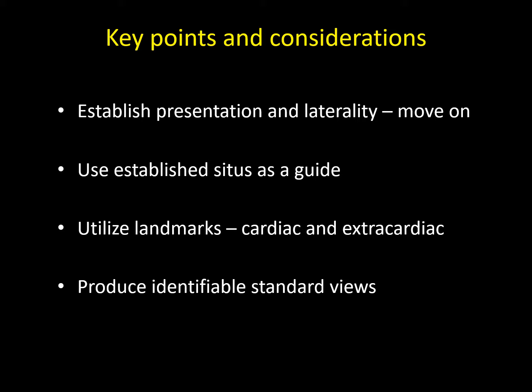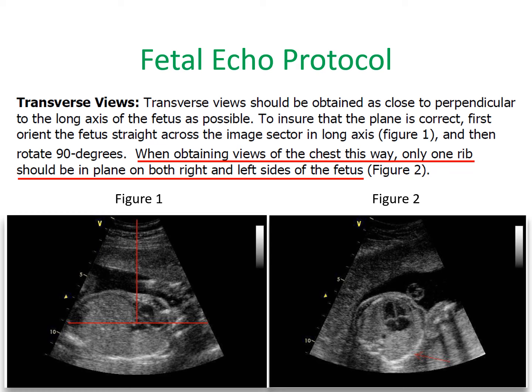Most importantly, you want to produce identifiable standard views — this is critically important for a successful scan. When starting in the transverse views through the fetal thorax, align the fetal spine as perpendicular as possible to the plane of insonation. At Children's Healthcare of Atlanta, we rotate counterclockwise 90 degrees, which allows us to obtain the fetal thorax in a proper standard format — seeing one rib on either side of the fetal thorax and a really nice four-chamber view of the fetal heart from base to apex.